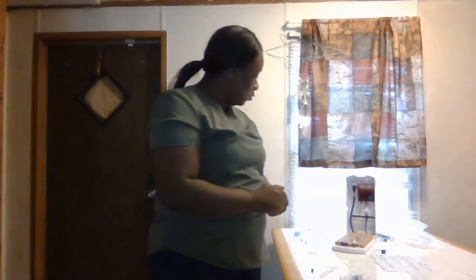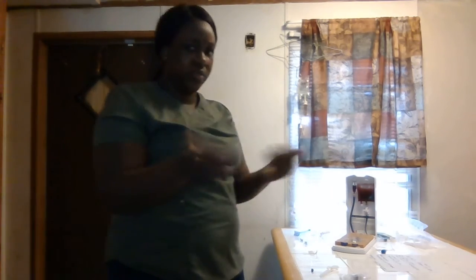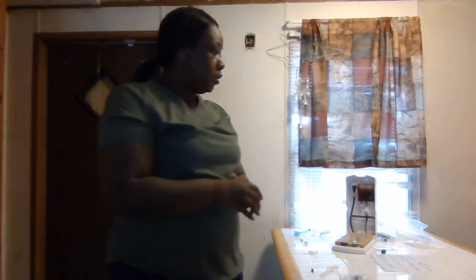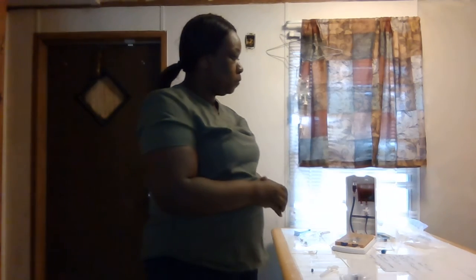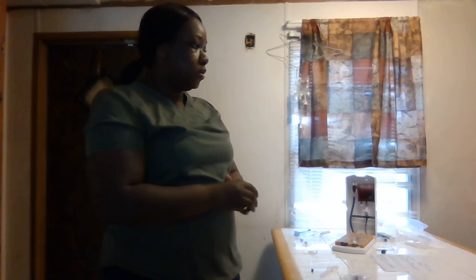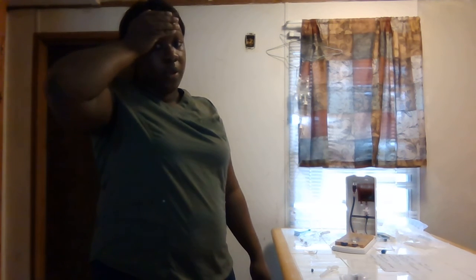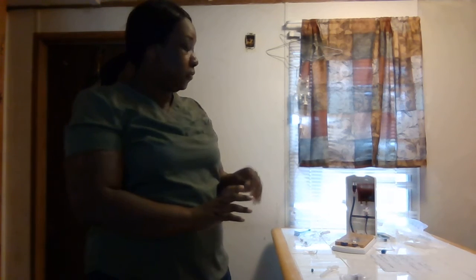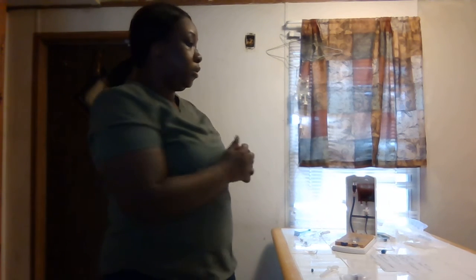Then we wash our hands, remove our gloves, and wash our hands again. Now, if I was pushing it through an existing line, the differences are that we always have to make sure our medication is compatible with the IV fluid and the medication itself.